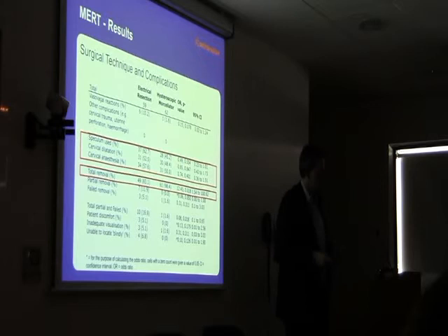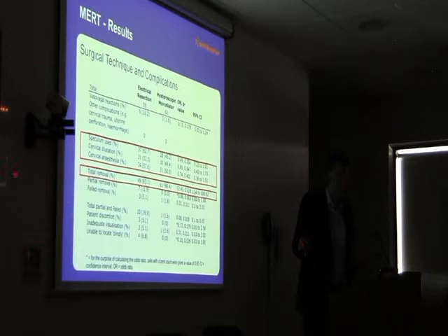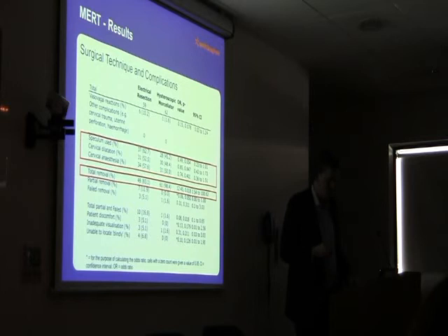But we're getting very similar here. Do you see 83% in the resection group? So again, that appears to be generalizable across the OPT trial, even though this study is only from two centers. My OPT trial was 30 centers. But if you look here at the morcellator, we only had one case where we didn't complete the procedure. So that's a huge difference, 98% success rate as opposed to 83%. So it seems to be not only quicker, less painful, more acceptable, but it appears to be more successful.